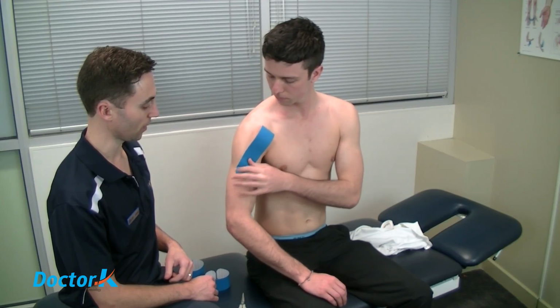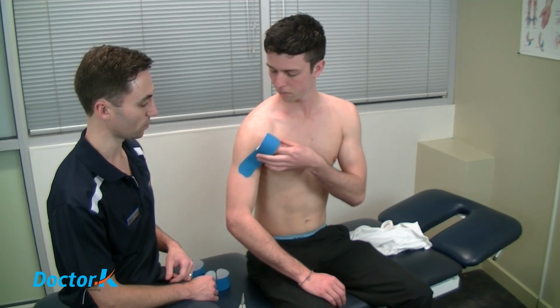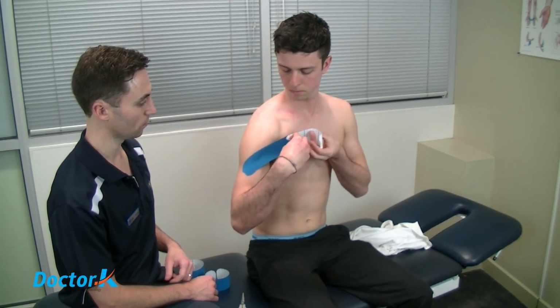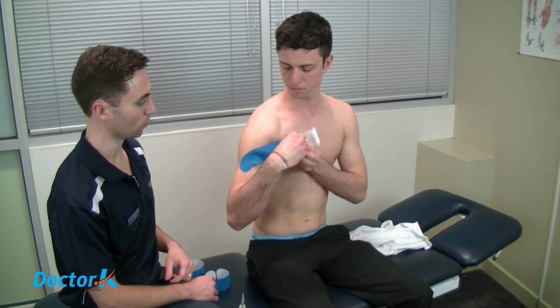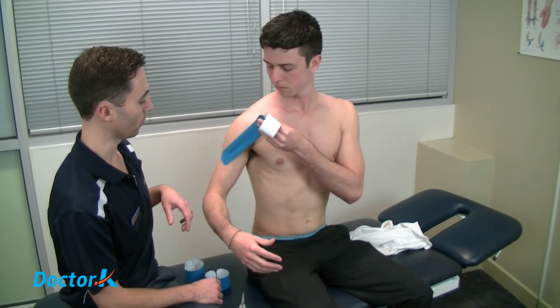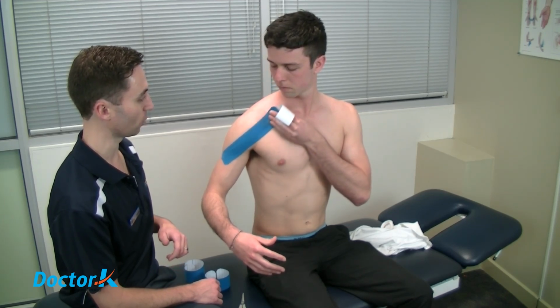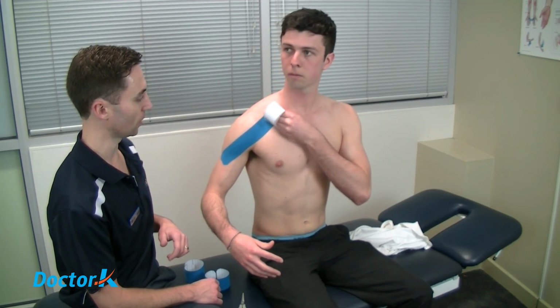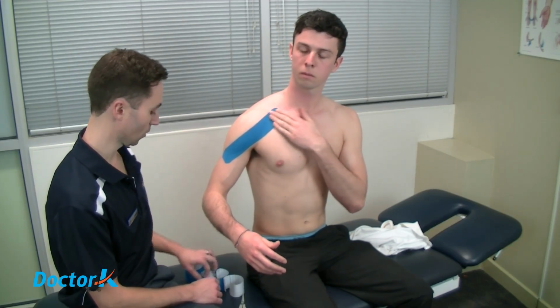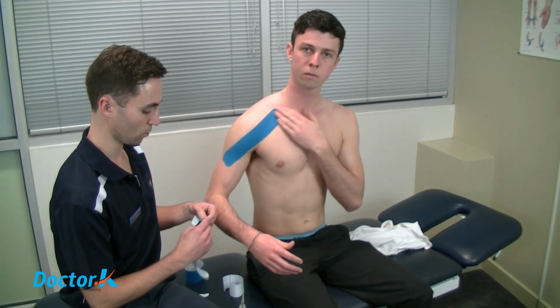And then you can peel that tape back the bulk of the way, so you're leaving that little bit of a tail still on the paper. And when you've got that prepared, you can open your shoulder position a little bit, and then with about 50% tension, run around that shoulder and aim to finish at around about your collarbone. And again, that little tail piece goes on without any tension. Good job.